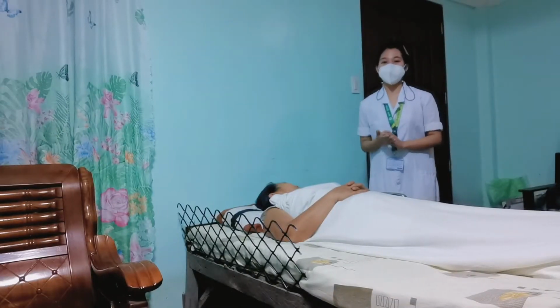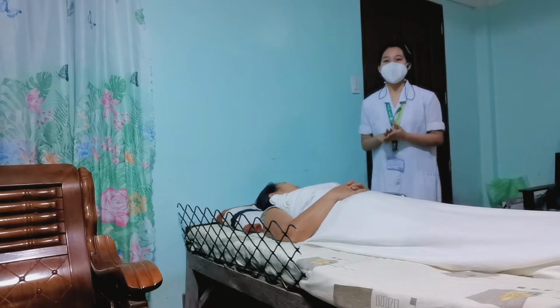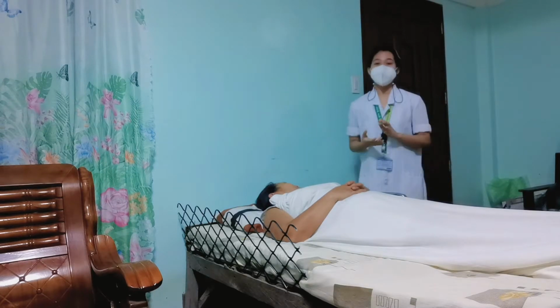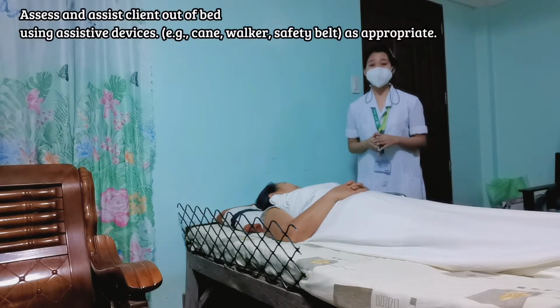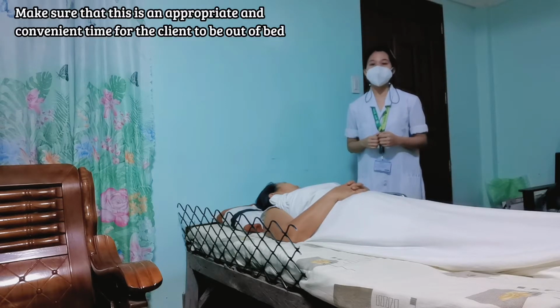I have already introduced myself to the patient, explained the procedures, asked for her consent, verified the client's identity, and provided her privacy. The next thing I will do is assess and assist. First, I'm going to assess whether the patient is able to stand up or unable to stand up. If the patient is able to stand up, then I will assist the patient to sit on the chair so I could perform bed making.